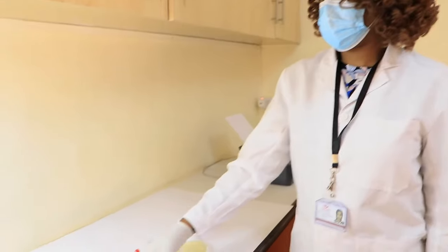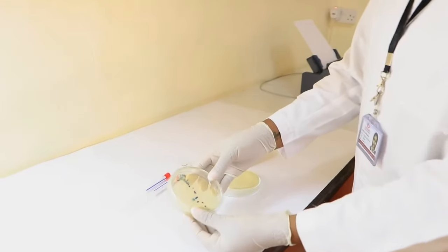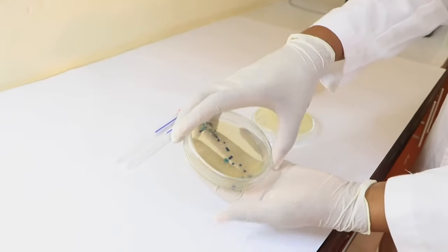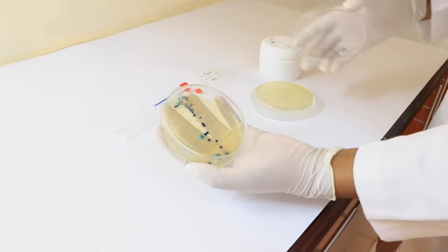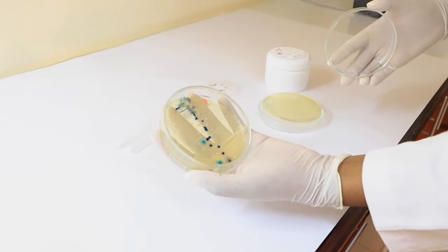After the plates have incubated for 24 to 48 hours at 37 degrees Celsius, count each colony on the plate. Each colony represents one bacterium which forms a colony and is called a colony forming unit.